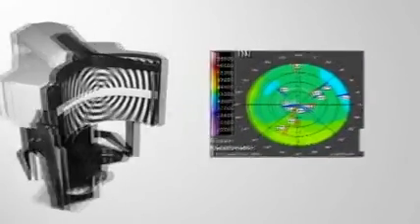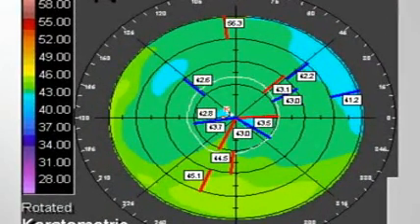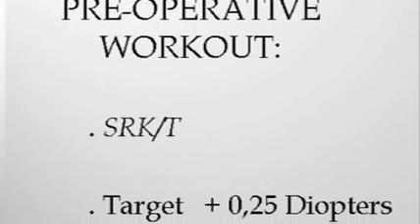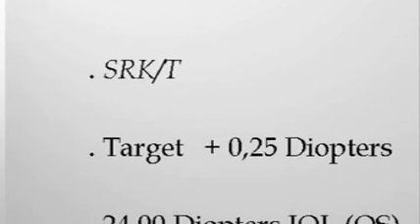To further investigate the case, we decided to use another technology in an attempt to assess the actual anterior corneal curvature for both eyes. We decided to perform corneal topography based on Placido disc reflection, obtained from Orbscan 2, Bausch & Lomb. These keratometric readings showed close similarity with computerized keratometry, but again, showed remarkable difference from those from PENTACAM.